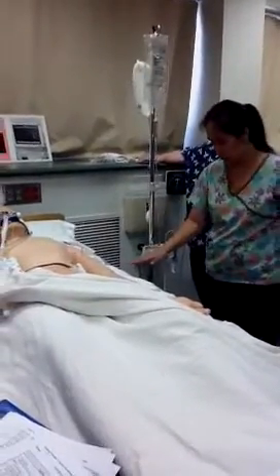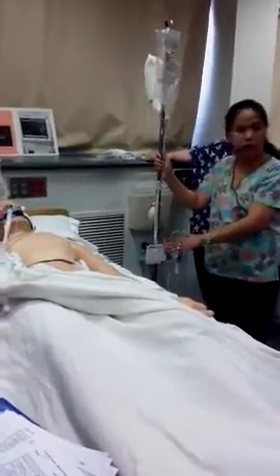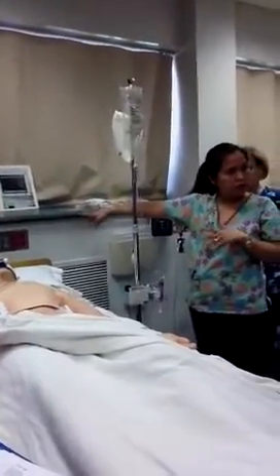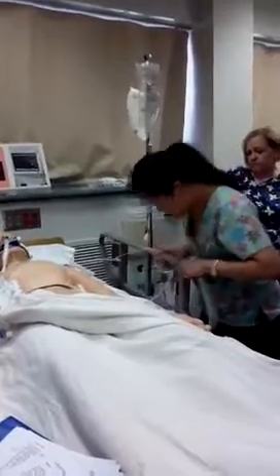But you level it to the point, so if you're adjusting the patient's head, moving them around, make sure that you also adjust this. Otherwise, you're going to get an incorrect reading, and you may be treating something that you should not be treating. Any question? Good question.